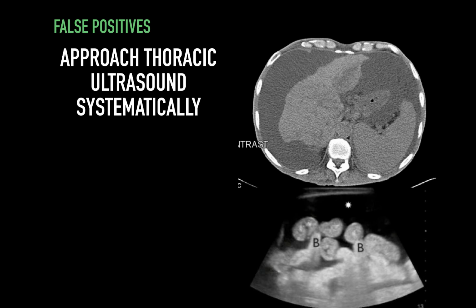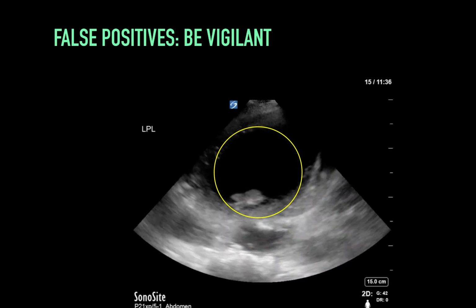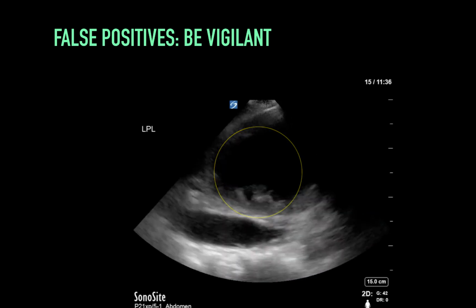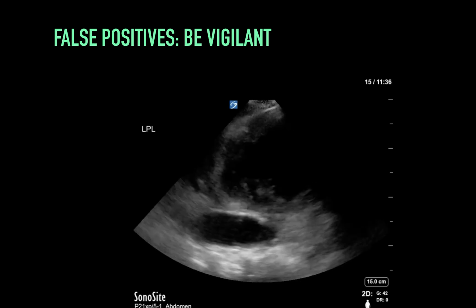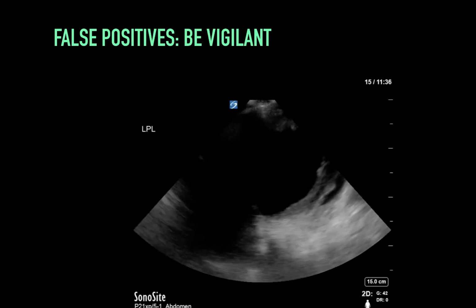If there's previous data like a CT or ultrasound showing ascites, then really I want you to be aware of such confounders. In this case, we see a large anechoic space. You should notice this anechoic space is beating. Yes, that's because this is the heart. This is a very large heart. This lady had cardiomegaly with a heart that encompassed the size of almost her entire left thorax. This is one important false positive you really don't want to miss.